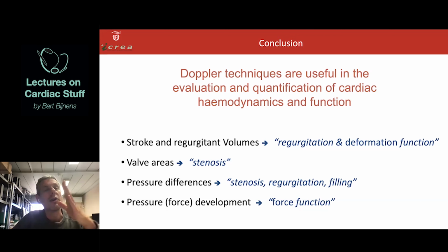The other thing is, for example, the error because of the angle of Doppler, which we don't know. That's extremely difficult to estimate because you would need to know the anatomy, so you would need to combine information. But even then, it's related to sample size, and to using certain simplified equations. I think we could estimate this, and I think we should in the future. At some point we have to try to take this into account when we provide measurements, but you're totally right that this is not done properly.